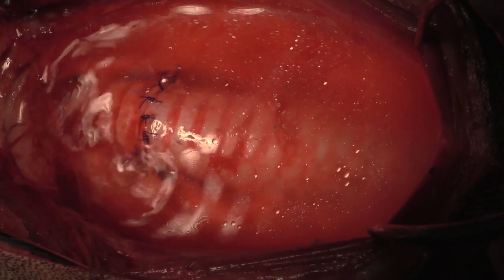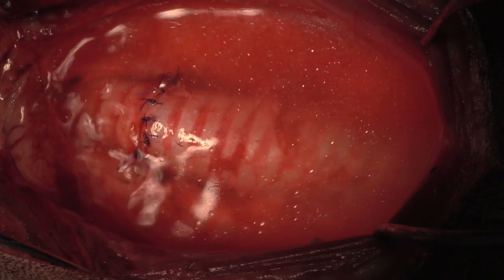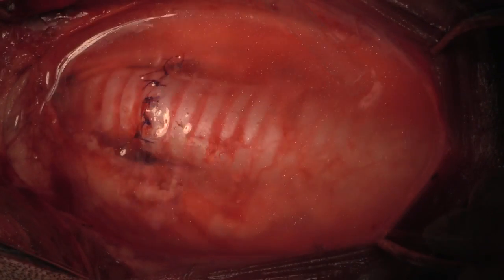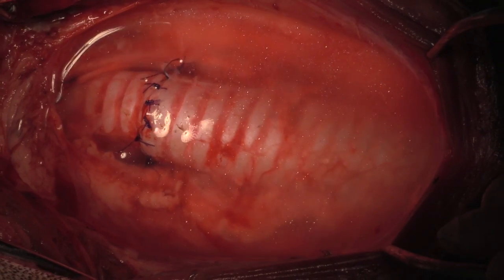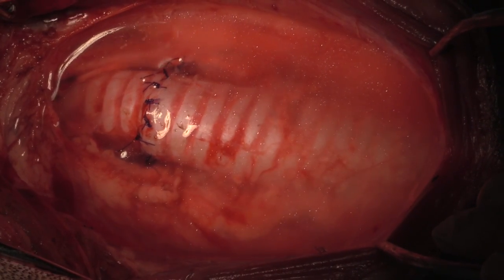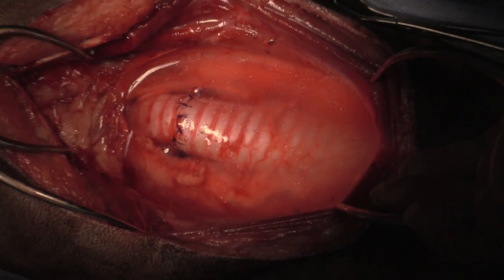The anastomosis was leak tested and when bubbles were found, a simple interrupted suture was placed. After placement of the interrupted suture no more bubbles were found and the surgery was completed.